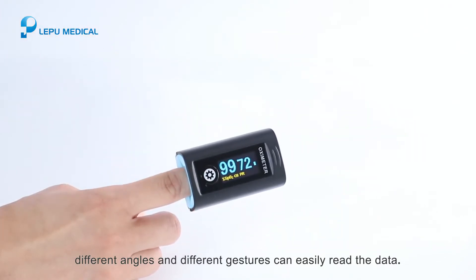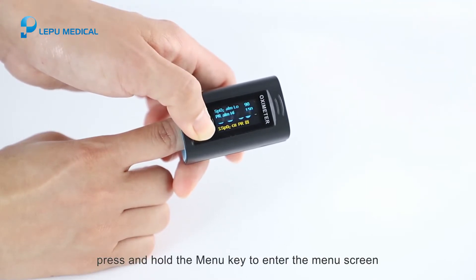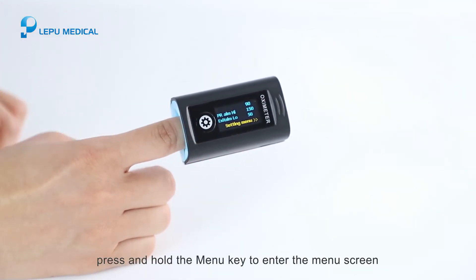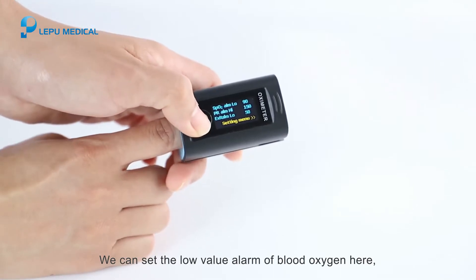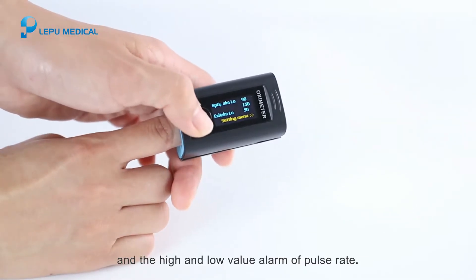At the measurement screen, press and hold the menu key to enter the menu screen. Here we can set the low value alarm for blood oxygen, and the high and low value alarms for pulse rate.